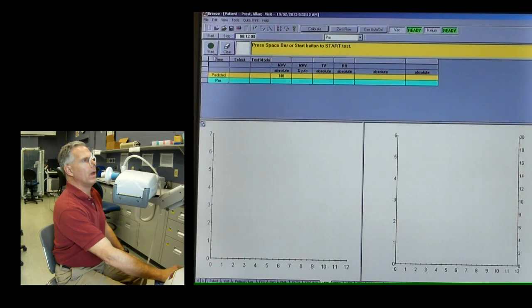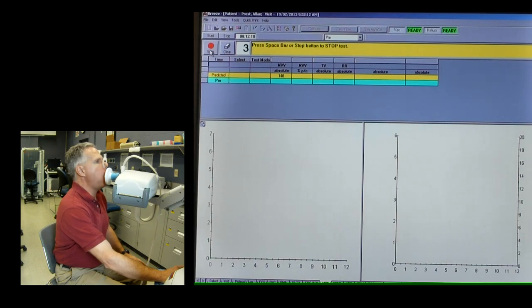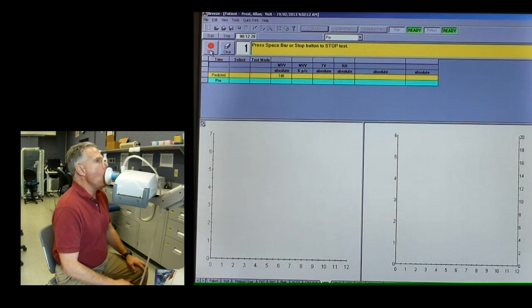Okay, so let's get the patient hooked up and get them breathing through there, and quite quickly coach them to start breathing hard and fast. Come on, harder. Come on, you can do better than that. Come on, breathe hard and fast. Keep going, keep going.